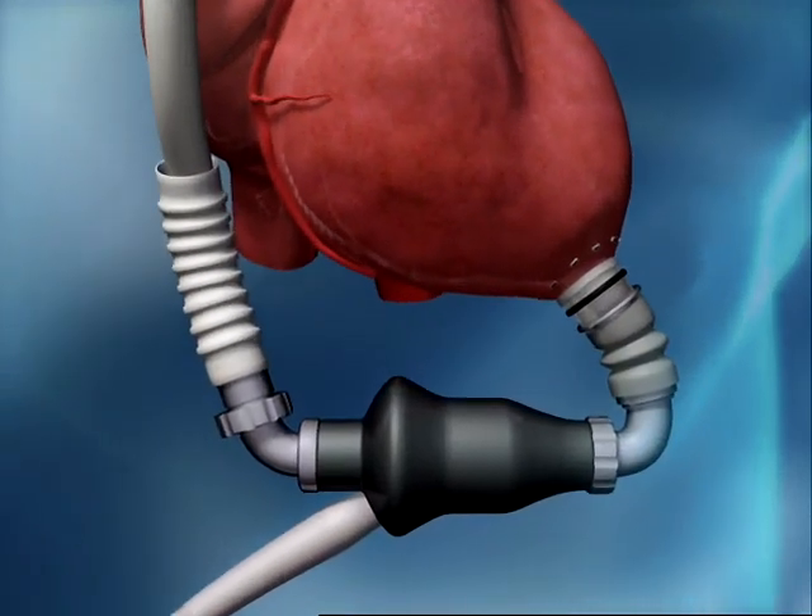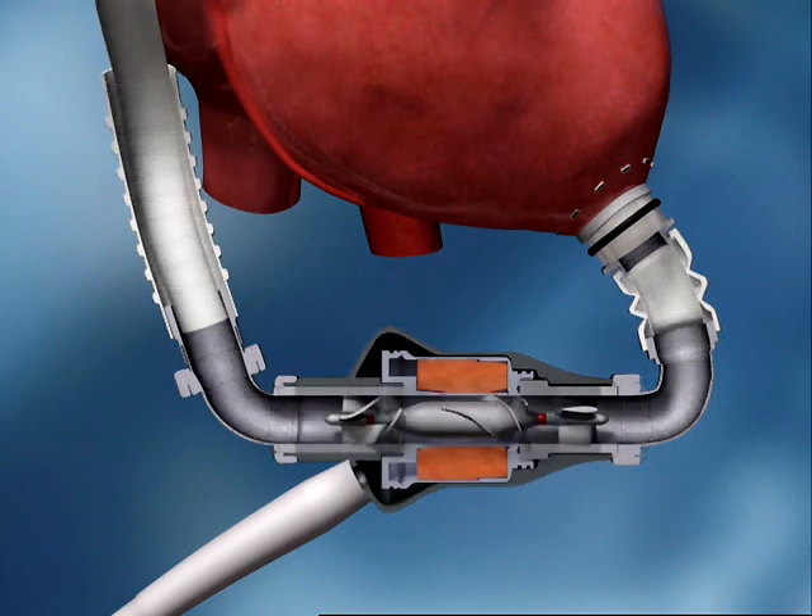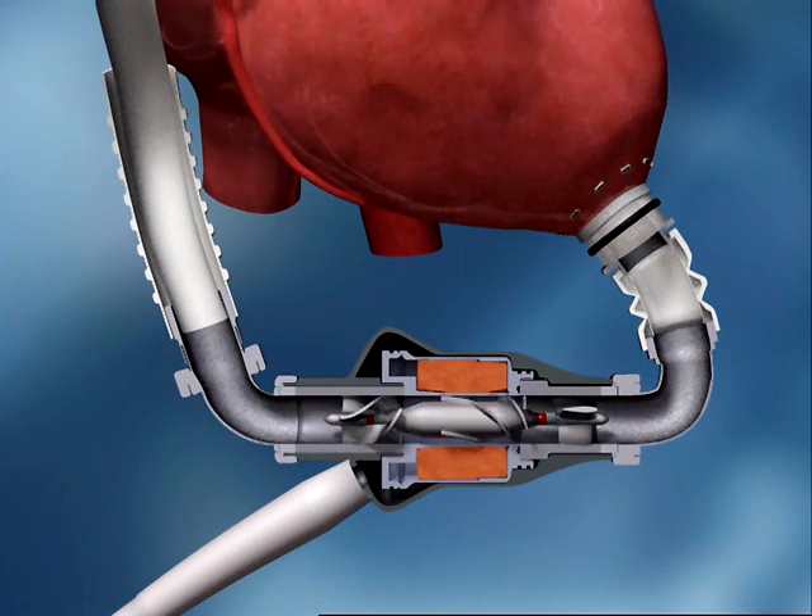60% smaller than currently approved implanted electric pulsatile LVADs and weighing only 400 grams, the HeartMate 2 incorporates precision engineering, a simple design, and 30 years of clinical experience. It is intended for long-term support as a bridge to transplant or for permanent implant known as destination therapy.